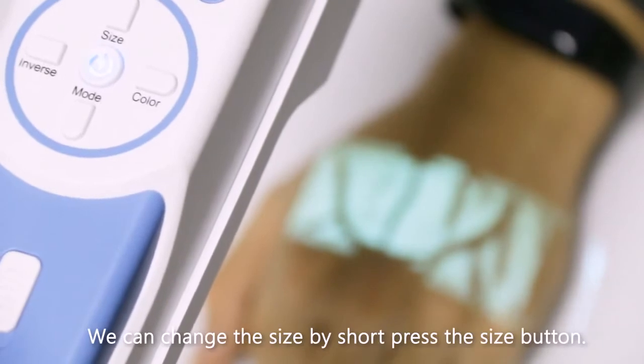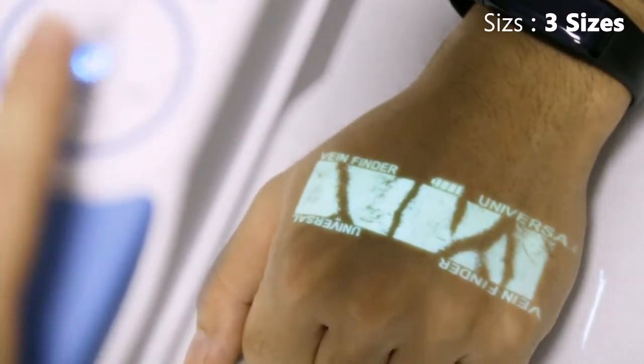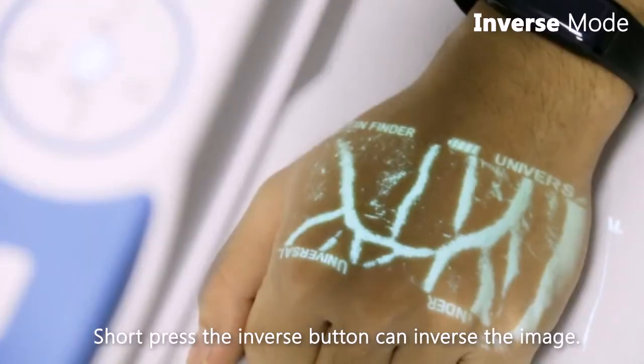There are three kinds of size; we can change the size by short pressing the size button. Short pressing the inverse button can inverse the image.